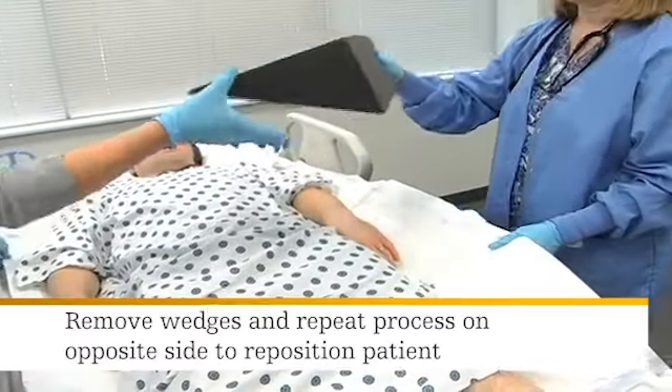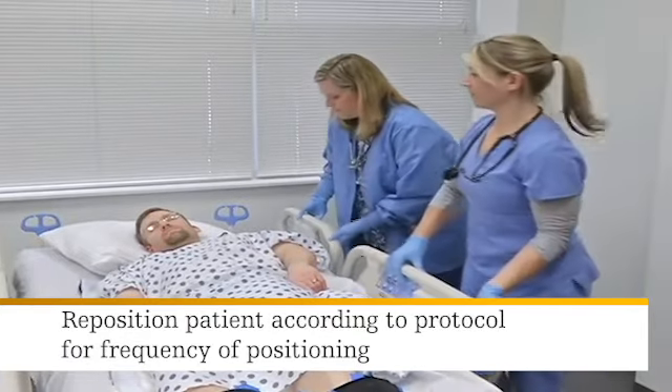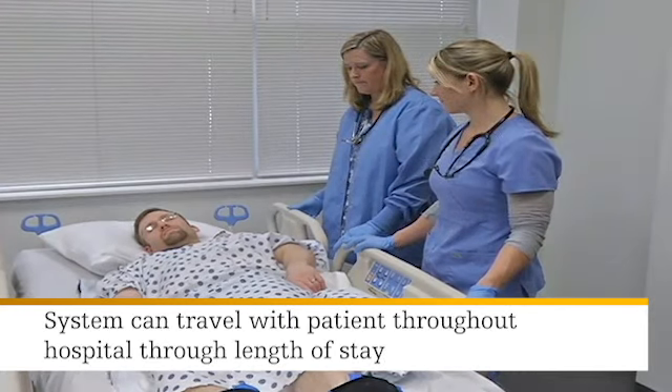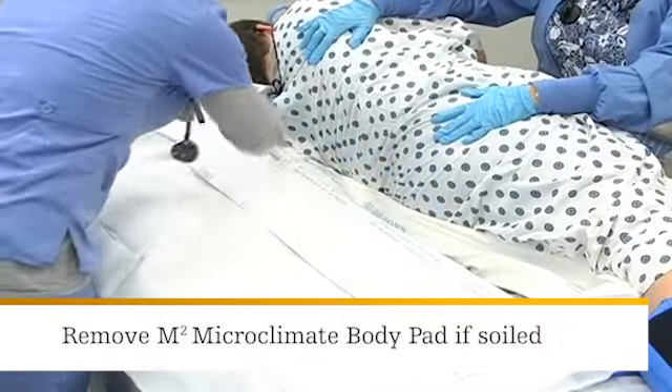To reposition the patient, simply remove the body wedges and repeat the process on the opposite side. Reposition the patient according to your facility's protocol for frequency of positioning. The Turn and Position System can travel with the patient throughout the hospital for the length of stay. The gray derma suede material on the top of the glide sheet has been engineered to hold the microclimate body pad in place.